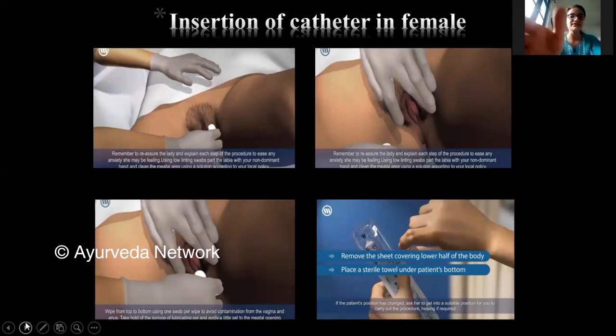Now here this cleaning process is nicely given. You will ask the female patient to stay in lithotomy position, and after she is in lithotomy position and you wear sterile gloves, you are going to clean the area. Now how do you perform this cleaning? You are again going to use a betadine solution or whatever else you are using for cleaning. You are going to clean the outer labia and the inner labia, from front to back.